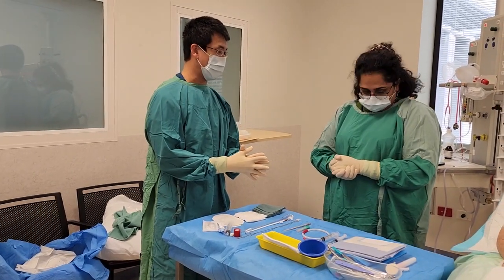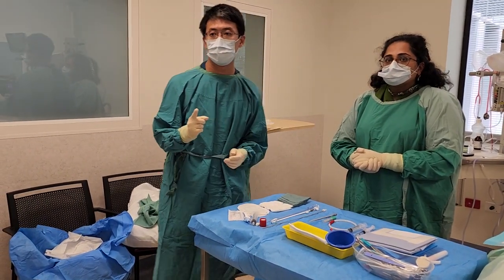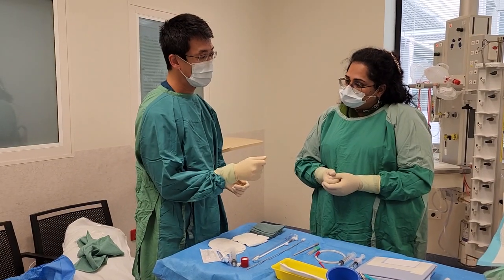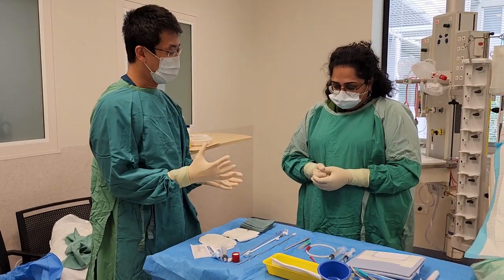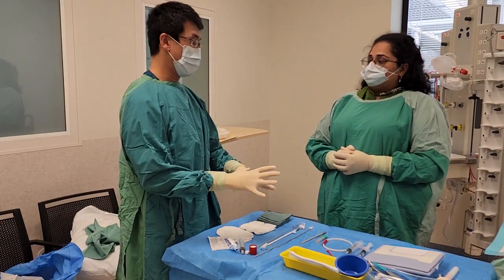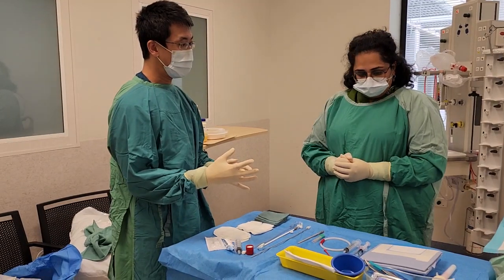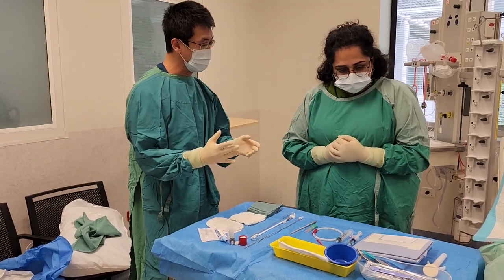So we've set everything up already. We're going to go ahead. And now, one other tip. Could you pause that? Wonderful. So we were talking about the triangle of safety. A couple of things of note. It's actually important to locate where you want to put the drain in before you put the drapes on. Because I've found that sometimes, when you clean the area and put the drapes on, you lose where all the landmarks are, so it makes it very difficult. I've seen people who know where the triangle of safety is, put the drape on, completely lose where they are because everything's covered, and get into trouble.